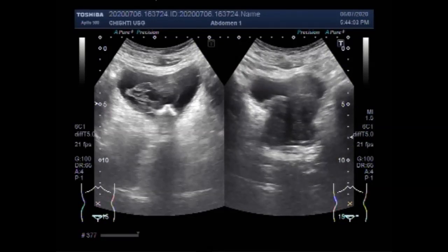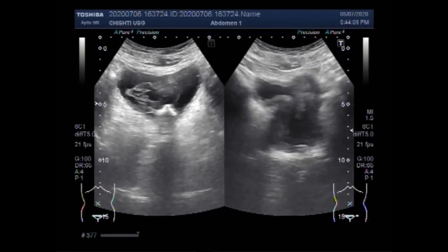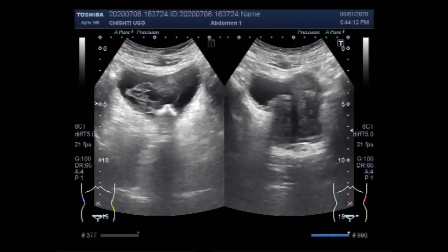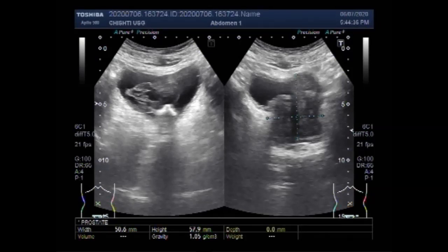This is the most common presentation in lower urinary tract findings, including poor stream, straining, hesitancy, frequency, and incomplete emptying of the urinary bladder. These are the common symptoms. Now you can see the measurement of the prostate — the weight of the prostate is about 95.4 grams, which is quite a large prostate.